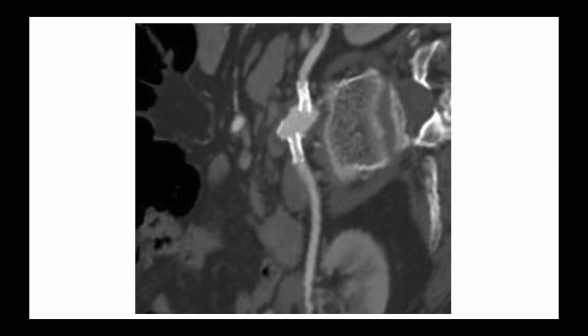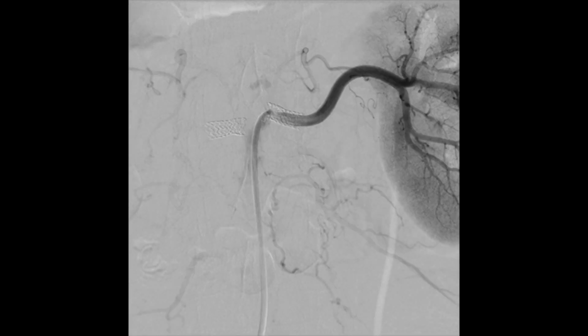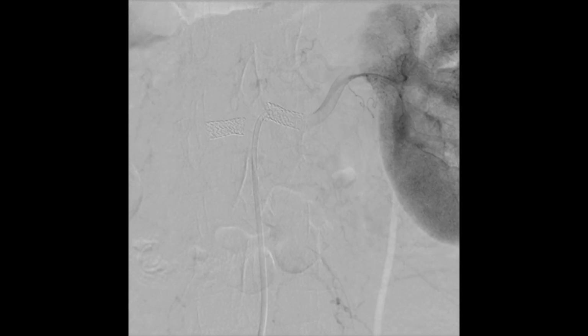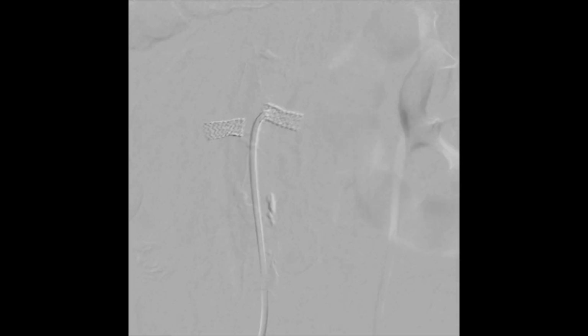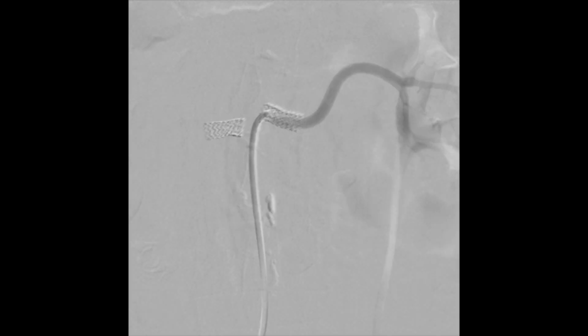This is a CT of the same patient done a little later. I don't remember for what purpose we did that, but you can very nicely see the aorto-ostial coverage of both stents. This patient remained fine for almost 5 years. She was in my constant follow-up. But November 2022, she again presented with uncontrolled hypertension and slightly impaired renal functions. Doppler ultrasound suggested bilateral critical ISR leading to bilateral renal artery stenosis.